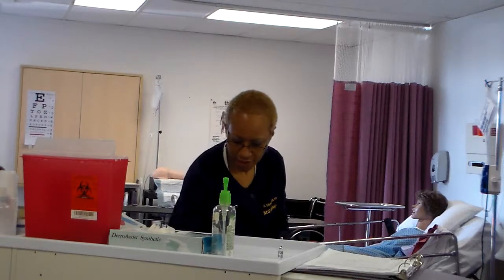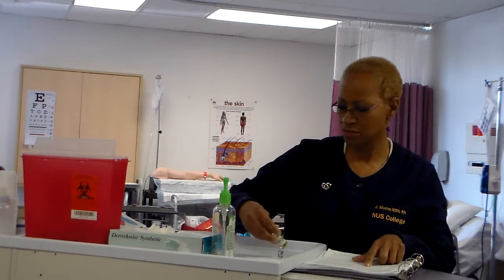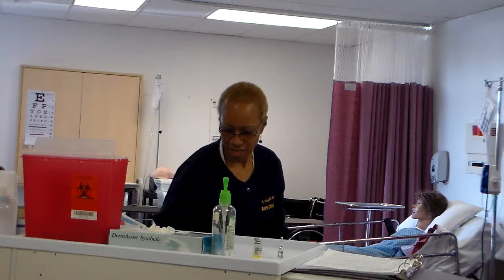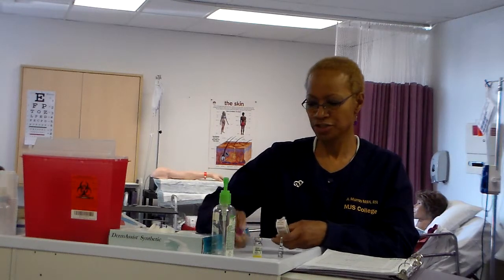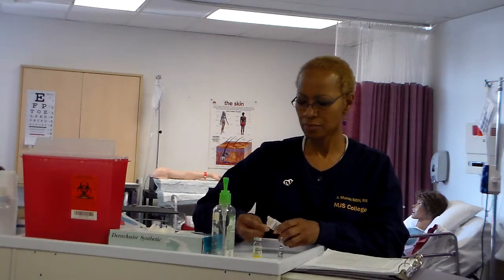So you're going to have an ampule, and you're going to have a vial, and you're also going to have a powder, making sure that you check the expiration date on each of your vials.